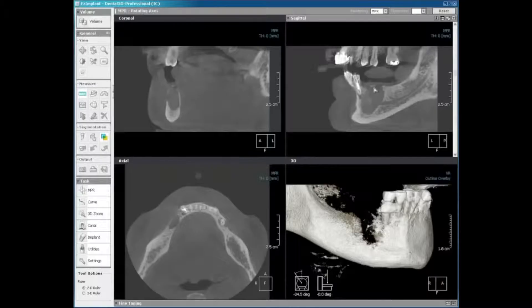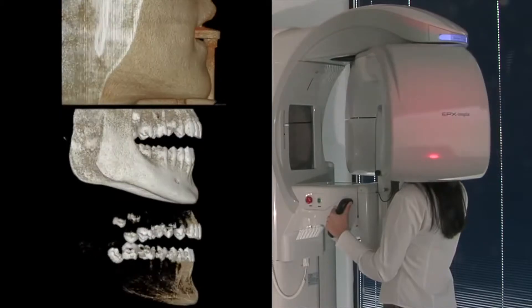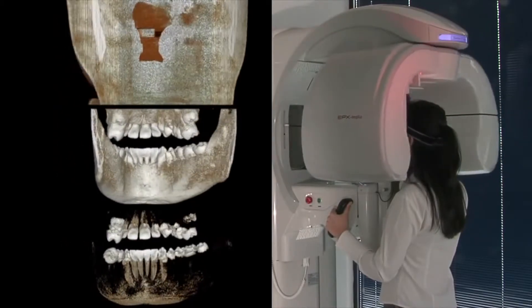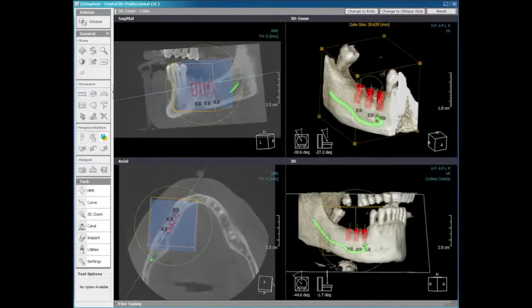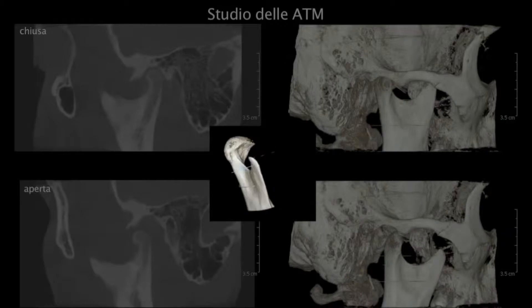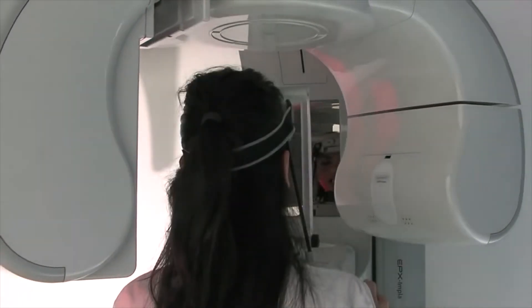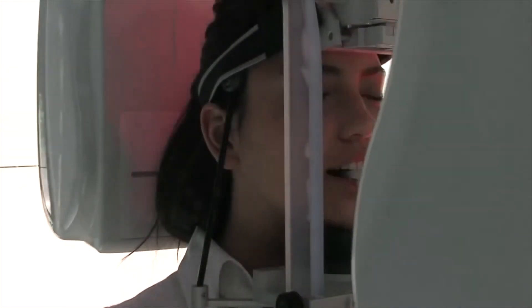The cone beam computed tomography allows us to view the arch and the dental bone in three dimensions, so we can see the width and height of the bone, where vital structures are, including the sinus and the nerve that runs in the lower jaw. It allows us to strategically place the implant to avoid all these structures and to be in bone. A scan is needed when placing an implant as it's become the standard of care. We can virtually place the implant on a computer, trace the nerve, and look at vital structures so we avoid these when placing the implant. A CBCT scan makes it more predictable, so we avoid vital structures such as the nerve and the sinus.